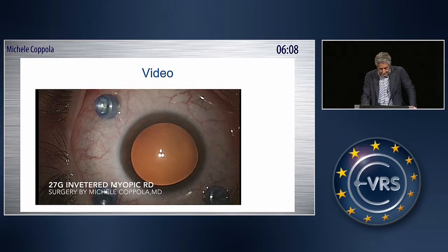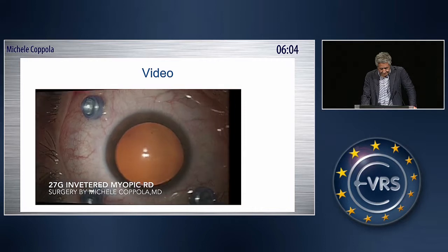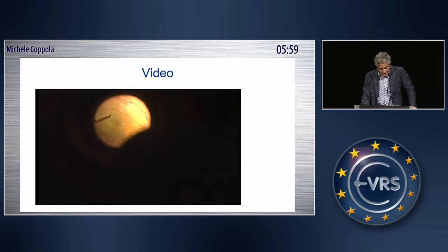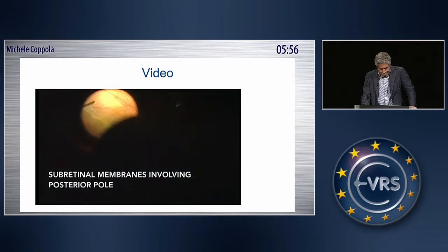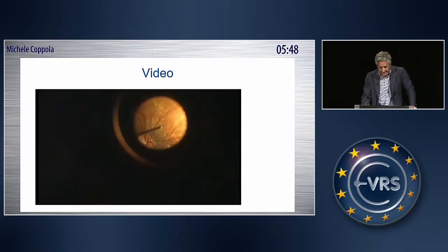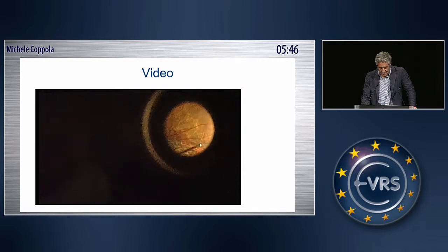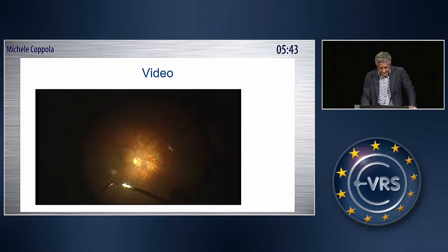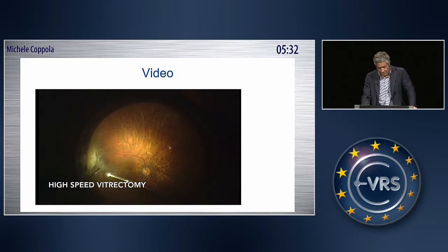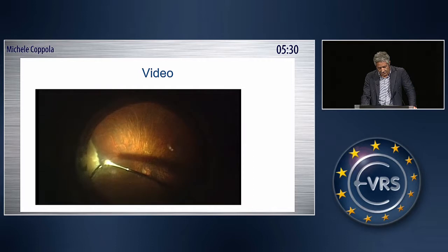So I show you immediately this short video. The surgery was performed with a 27 gauge. And you can see how the subretinal membrane involved completely the macular area. And it's interesting that we were able to obtain also a complete posterior vitreous detachment during the surgery, and I can show you.